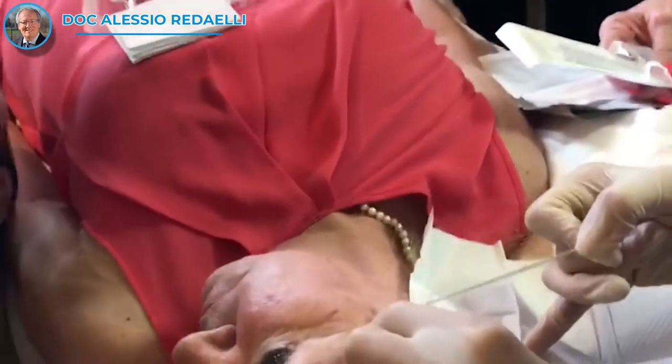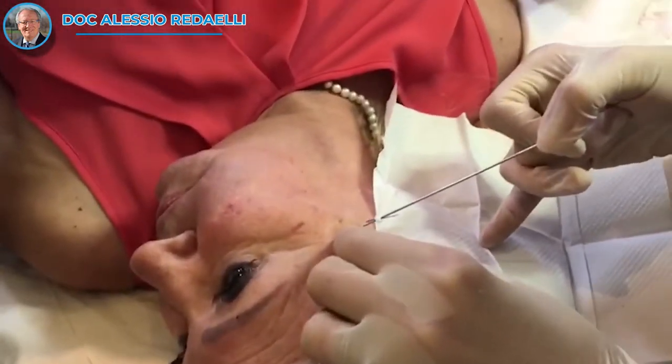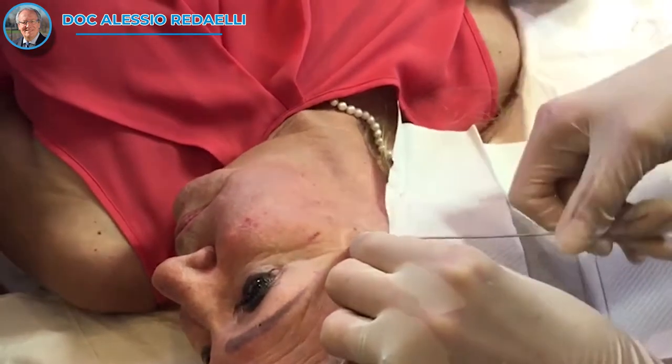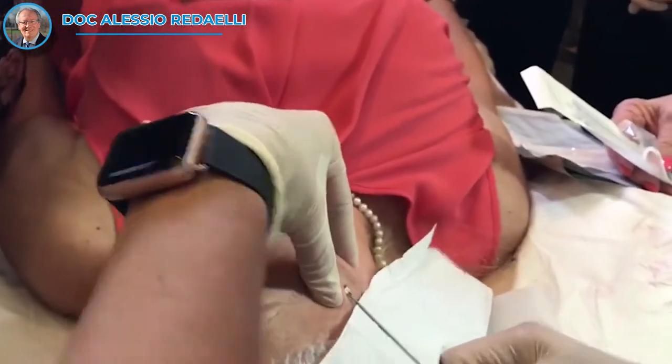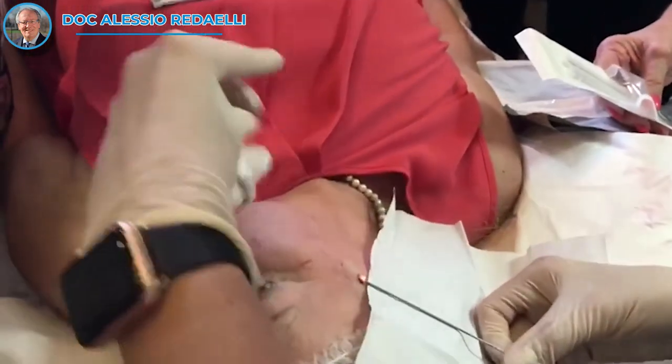My insert, it's a deeper plane, so you first insert perpendicular to the skin and then you change your angle. Now here I can feel the zygomatic ligament — it's got quite strong tissue.